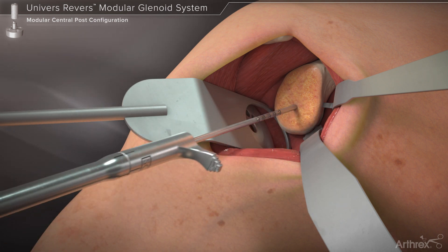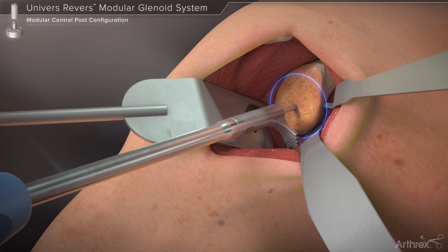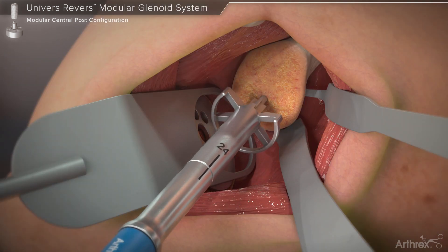The glenosphere sizing guide may then be placed over the guide pin to visualize the location of the inferior most rim of a chosen glenosphere size. Each step in the guide corresponds to a size of glenosphere offered within the modular glenoid system. If determined that the position of the glenosphere is not ideal, the surgeon may remove the pin and reposition it. The primary reamer corresponding to the base plate diameter is introduced over the guide pin.